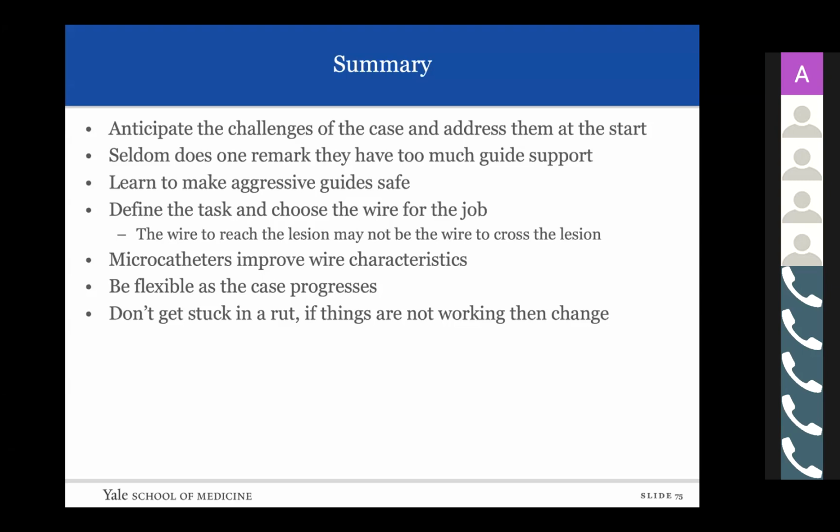Microcatheters greatly improve every characteristic of the wire that you're trying to do. Be flexible. Don't get stuck in a rut. And if things are not working, don't spend more than a few minutes, change to something else, because there's only three things that don't work in the lab. It's either you're not working, which you can't really change at that point, the patient's not working, you can't really change that at that point, or your gear. So the gear is the thing to change.